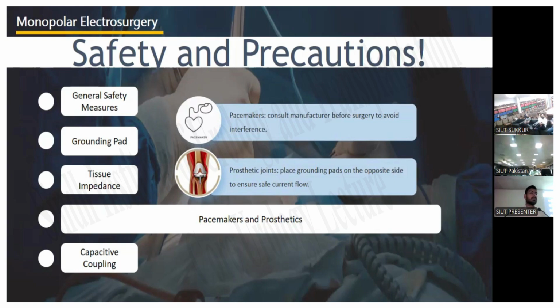We usually use bipolar energy, or we can call the cardiology team to match the frequencies of the pacemaker and the monopolar device. So why do we use bipolar? Bipolar has two poles between which the current flows, not through the body of the patient. Therefore, it won't affect the pacemaker. The current won't pass through the area of the pacemaker.